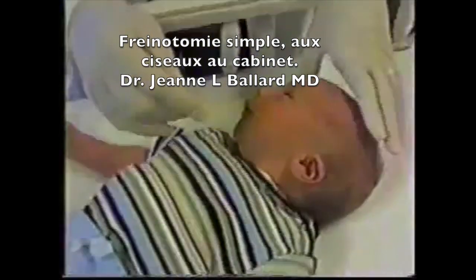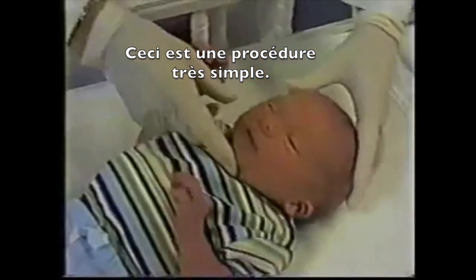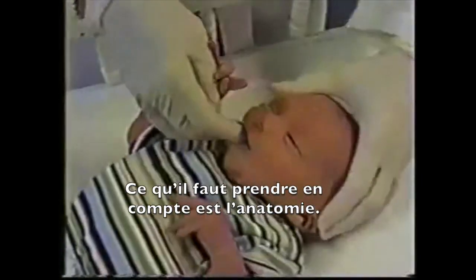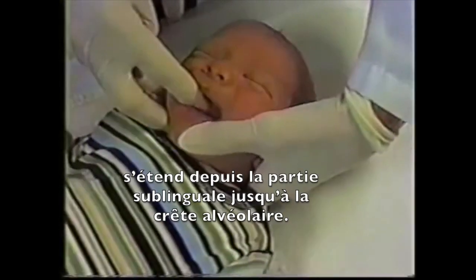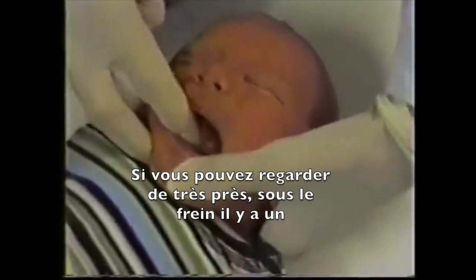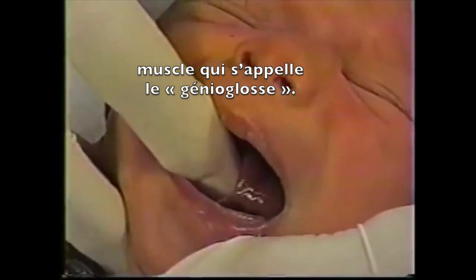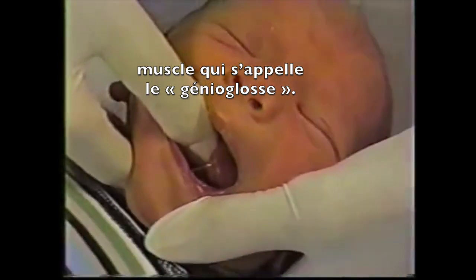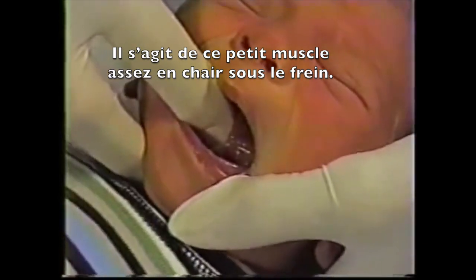The procedure itself is very simple. What we do is pay attention to the anatomy. If you notice, under the tongue, this membrane or frenulum goes from the tongue to the alveolar ridge. If you can look very closely, under the frenulum there's a muscle called the genioglossus muscle — it's that little beefy muscle beneath the frenulum.